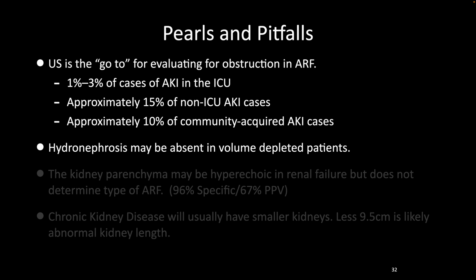Another thing to keep in mind, that hydronephrosis may be absent in volume-depleted patients regardless of what type of hydronephrosis or cause they have. So whether that's a ureteral lithiasis or a mass, if they're volume depleted, that may not be as apparent. There is some data out there to say that if you give them a 500 ml bolus of fluid, that will make the hydronephrosis appear.